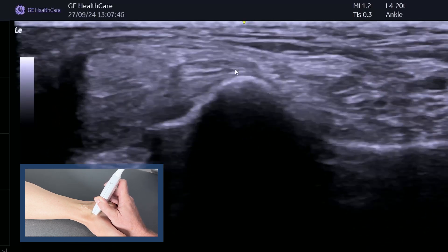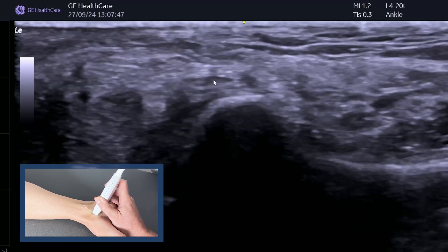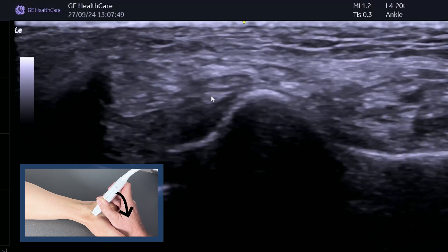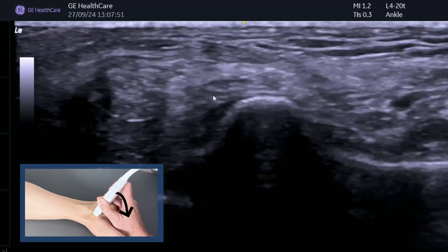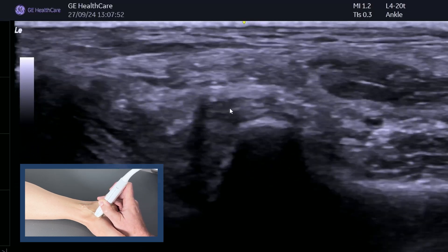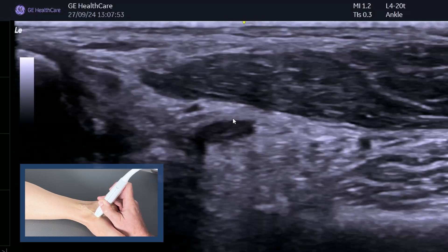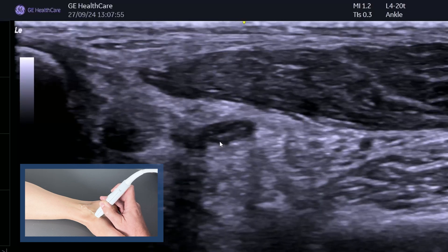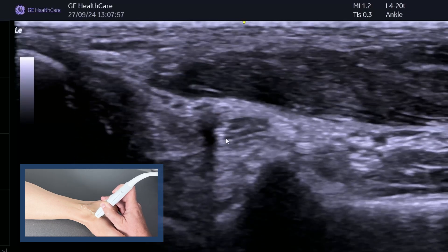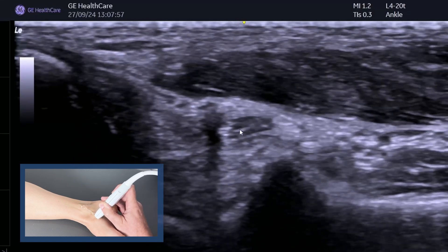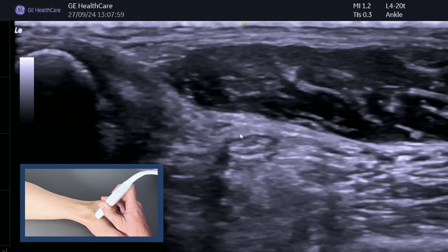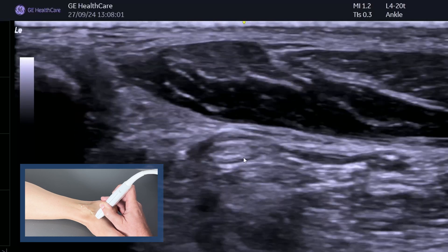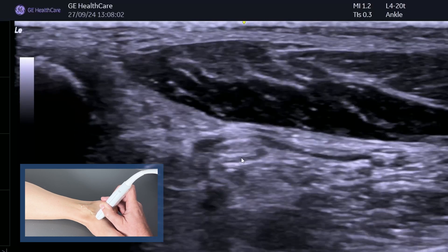As we come down you will lose it a little bit. You need to tilt even more. As we keep going, you can see it goes dark because of anisotropy. If I just tilt the probe, I make it nice and bright. As we come around the corner, you need to then identify FHL.